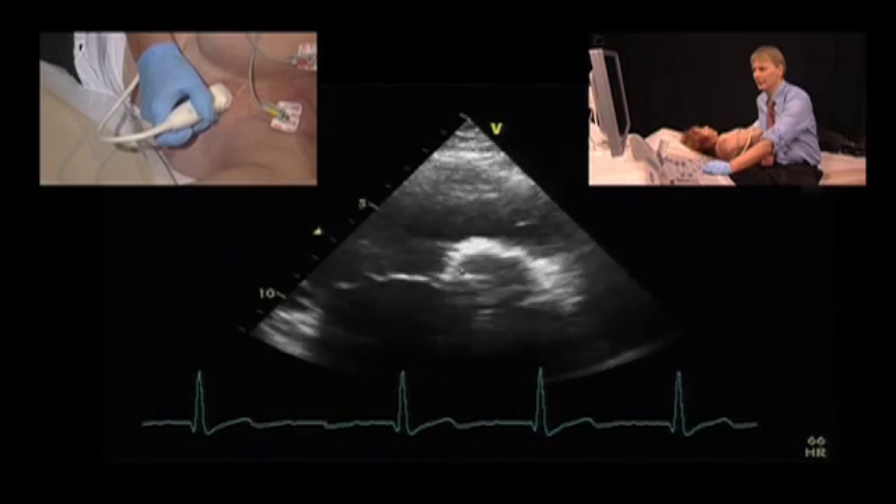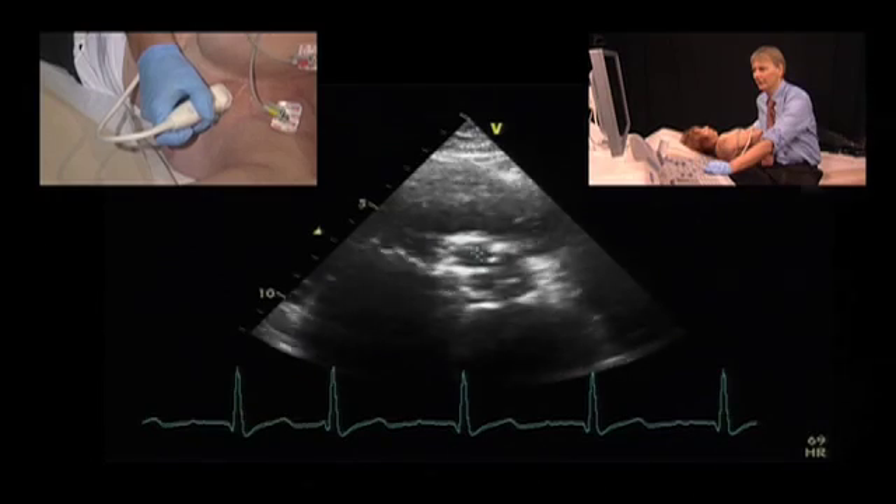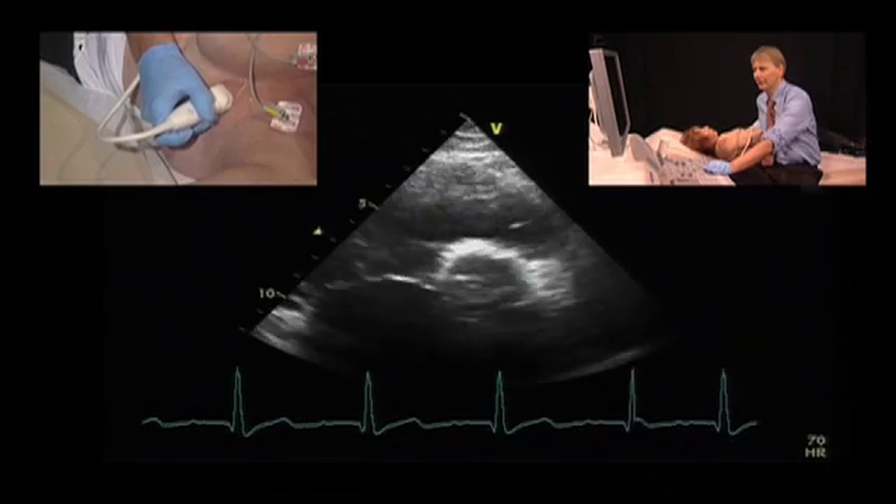This is one strut, this is the other strut, and this is the third strut. And here in between we have the three leaflets of the valve.